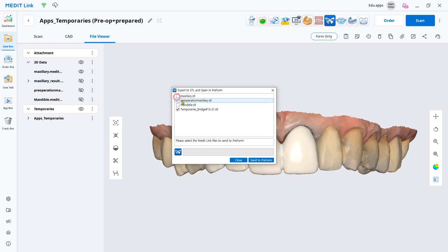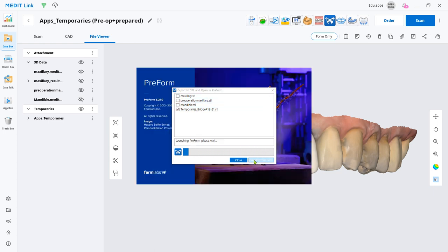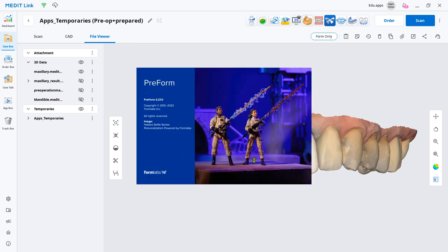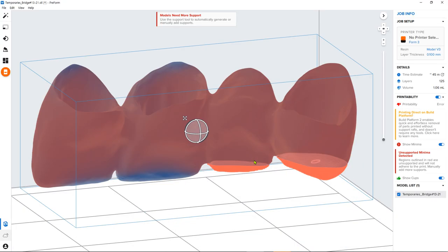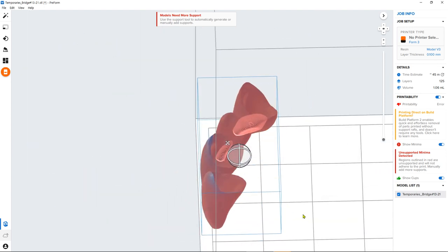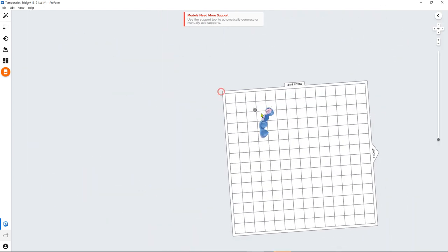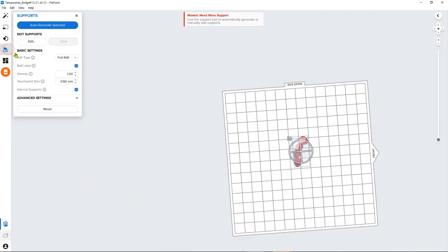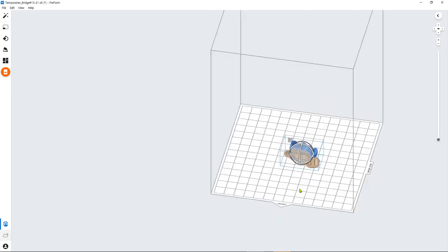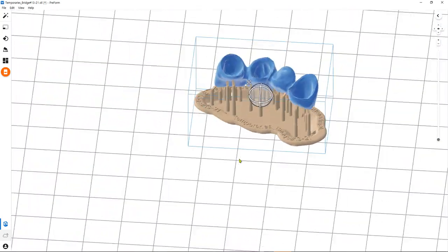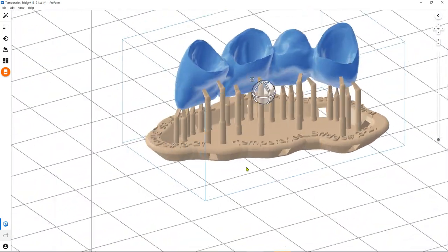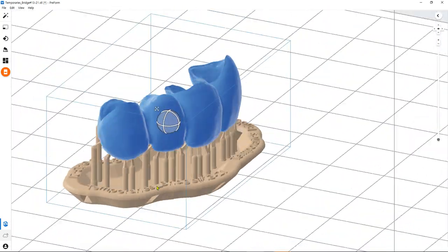Now, you have a 3D printable temporary. If you are using a 3D printer from one of our partners, you can export the temporary file directly to their software from MeditLink and make the final preparations before printing.